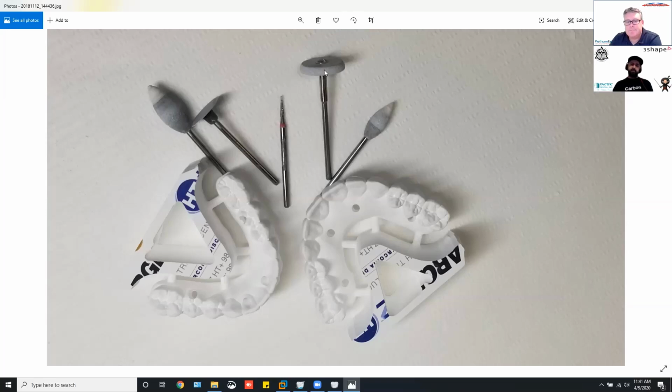Of course. On top of this, this is the Brasler tool to cut the sprues down and clean up sharp edges on the support brace. I will actually go in with this, a Wagner burr tool, right here. It's a rubber wheel, isn't it? Exactly, and it's super thin and flexible. I'll open up the embrasures, and this one I'll actually go in and smooth out. Sometimes I get my Z's off a little bit, I'll get little step lines. I'll go in and smooth it off.